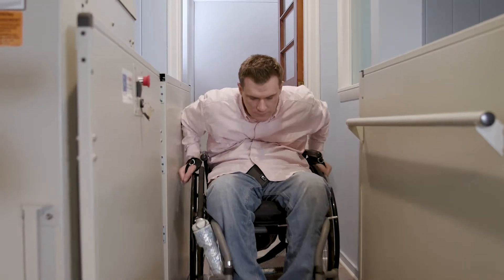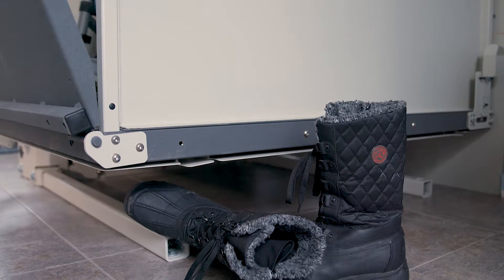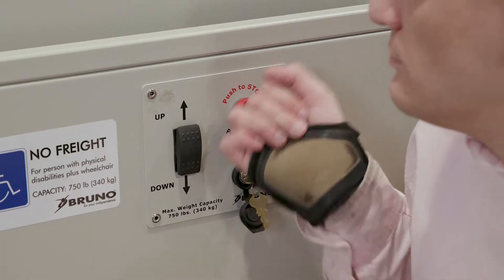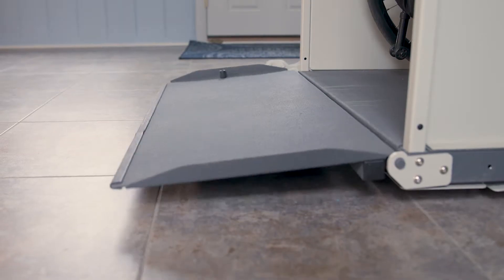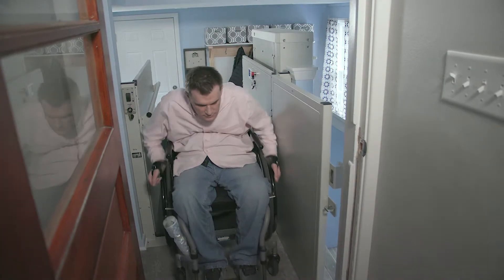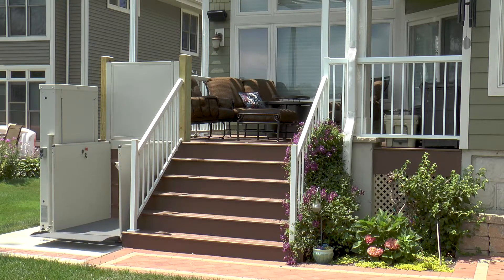Bruno Vertical Platform Lifts feature safety sensors to ensure the lift stops if an obstruction is sensed under the lift. Every Bruno Vertical Platform Lift offers a 750-pound lift capacity, made in the USA quality, and a 2-year limited warranty.